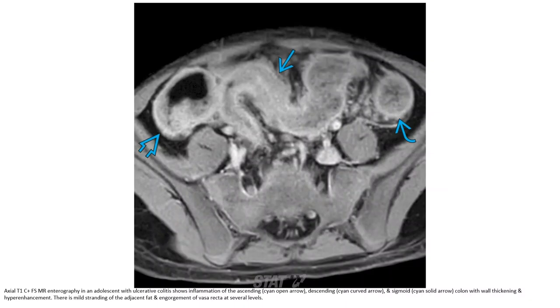This is a T1C+ fat-saturated MRI enterography. In early adolescence, the ulcerative colitis shows inflammation of the ascending, descending, and sigmoid colon with wall thickening and hyperenhancement. There is also mesenteric stranding of the adjacent fat and engorgement of the vasa recta at several levels.